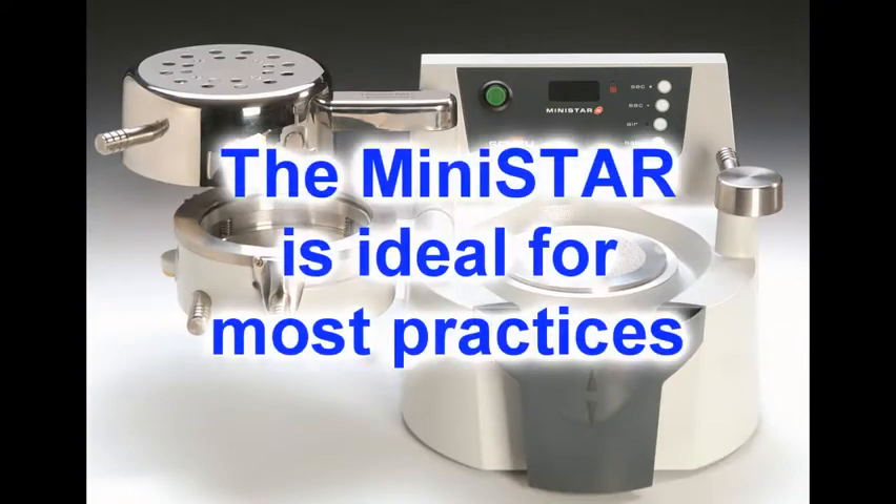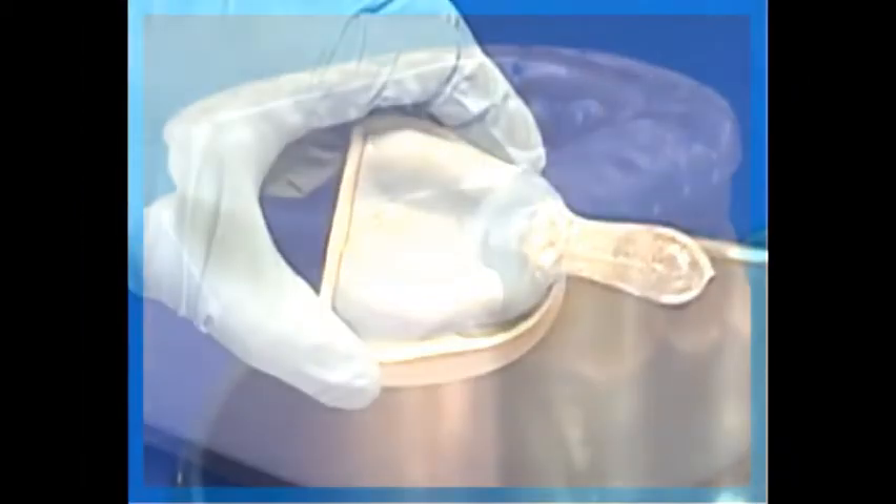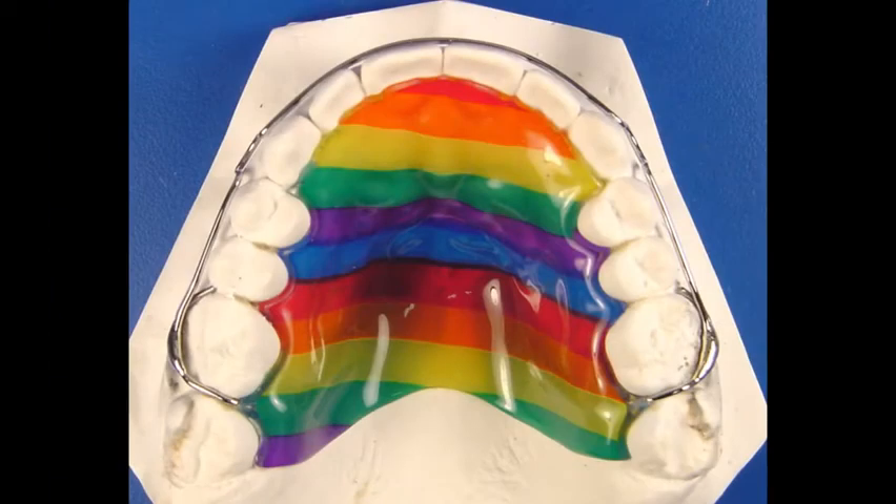For most dental practices, the MiniStar is ideal. You can use the MiniStar to fabricate the same extensive variety of appliances that you can with the BioStar.